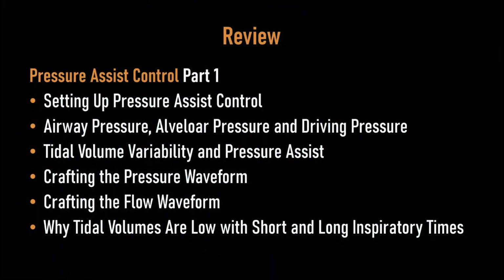We can now review this tutorial. In this tutorial, I talked about pressure assist control, and this is the first of 2 tutorials. And this tutorial is really about looking at the basics of using this mode of ventilation in a relatively healthy set of lungs. So I talked about setting up pressure assist control ventilation, and then we looked at airway pressure, alveolar pressure, and driving pressure.